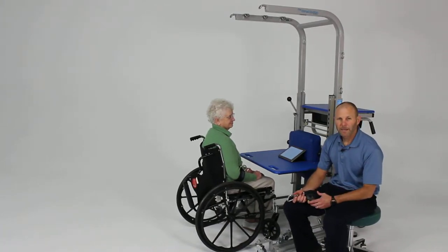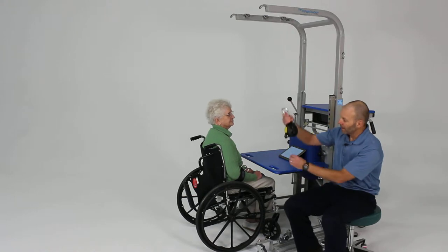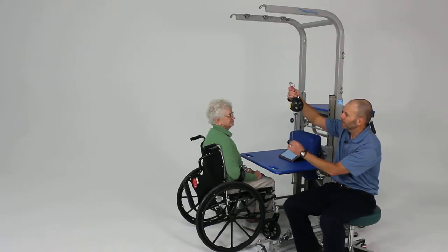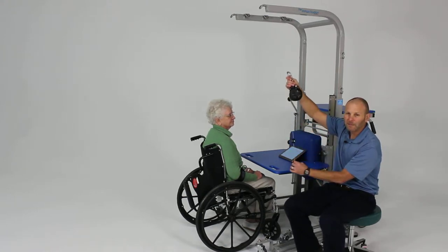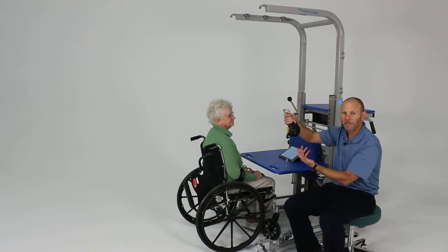The Rehab Station is an excellent device for providing numerous opportunities for upper extremity types of activities. One of the things we're going to demonstrate now is the use of the EasyReach. The EasyReach is a dynamic assist device that provides the upper extremity some support and assistance during functional activities.